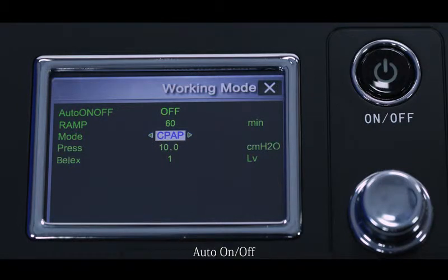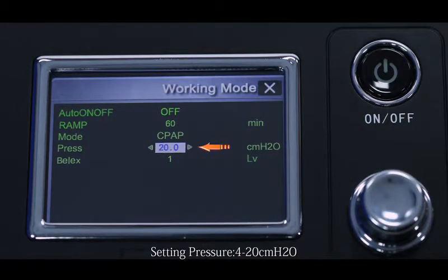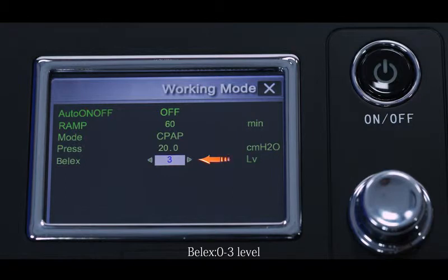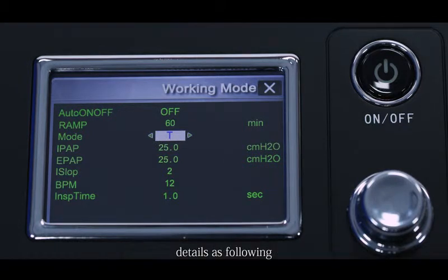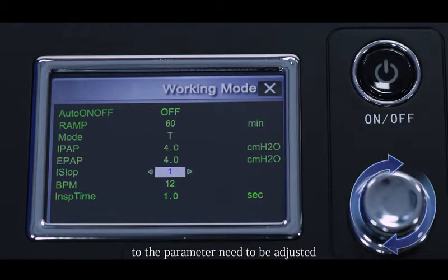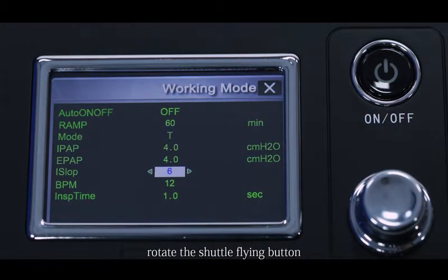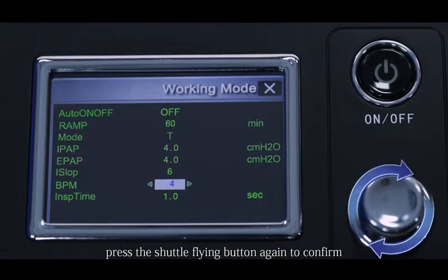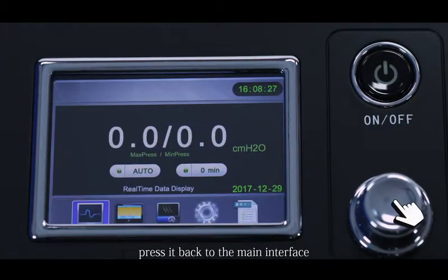CPAP mode settings: Auto on/off. Ramp: 0 to 60 minutes. Mode: CPAP. Setting pressure: 4 to 20 cmH₂O. Flex (EPR): 0 to 3 levels. Each option can be adjusted as required. Rotate the shuttle button to the parameter to be adjusted, press to enter edit mode, rotate to the appropriate value, and press again to confirm. Rotate to the top-right X close icon and press to return to the main interface.